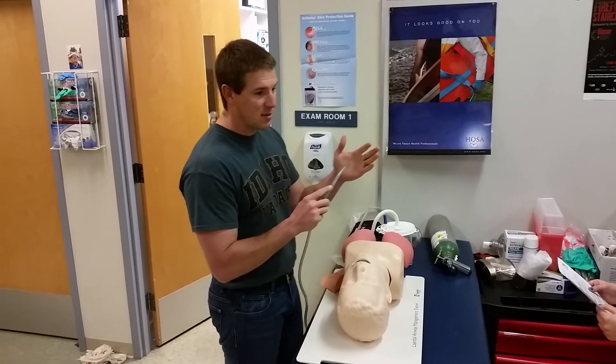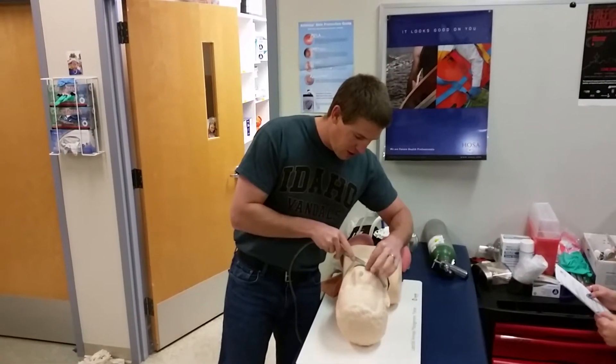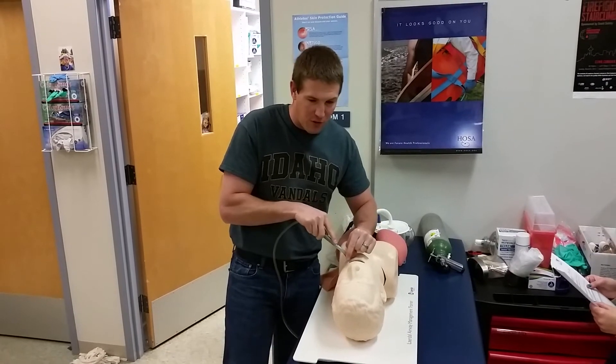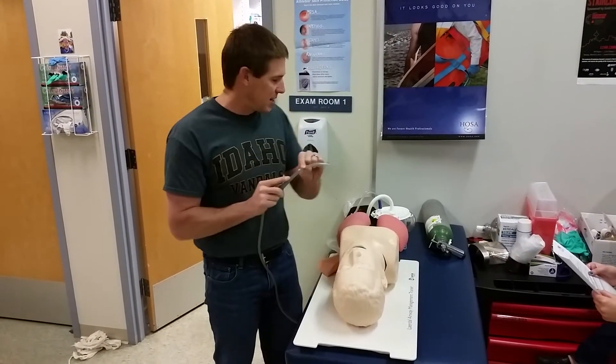The mouth is full of secretion, so suctioning is needed. Turn on the suction unit and test to confirm suction is present. Measure from the corner of the mouth to the earlobe. Insert the catheter with suction off, then apply suction, moving back and forth for a maximum of 15 seconds. Remove with suction on.